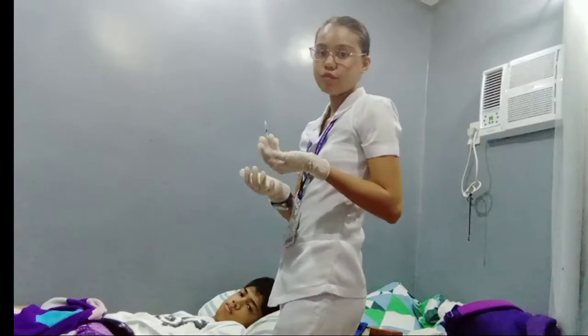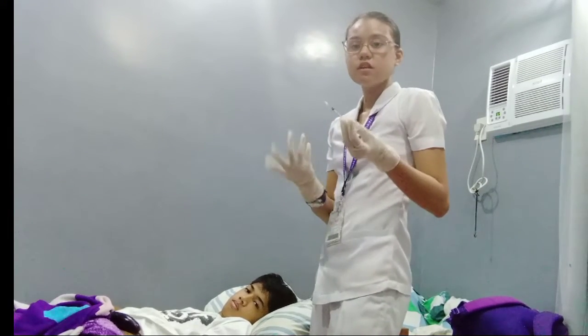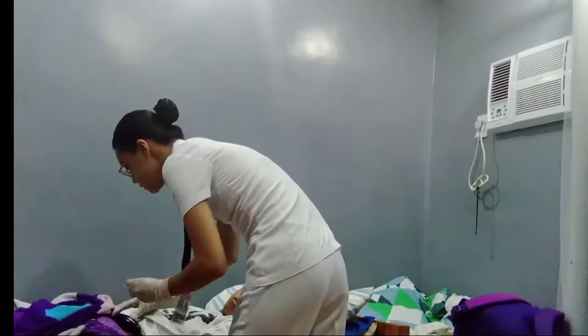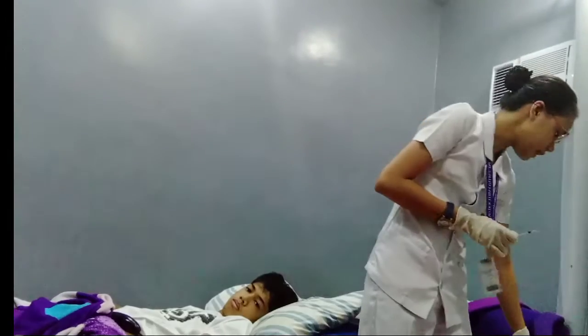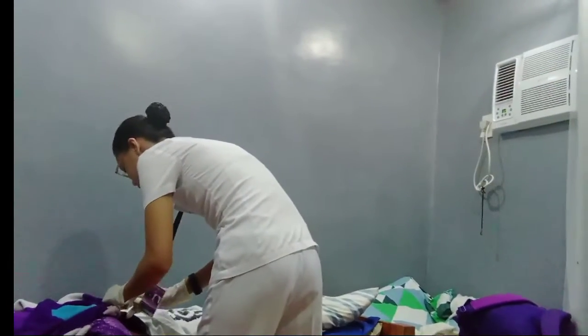Okay. Afterwards, we need to move our dominant hand to the end of the plunger and slowly inject the medication over several seconds. This is to retain your grasp on the syringe to keep it still. Okay. Quickly withdraw the needle, place a swab or gauze pad on the site and apply gentle pressure but don't massage. So this is to avoid unintended absorption patterns. Again, using a cotton ball soaked in 70% alcohol.